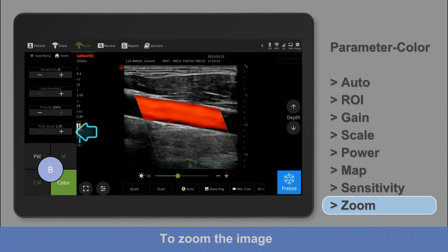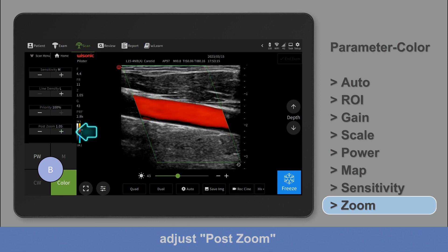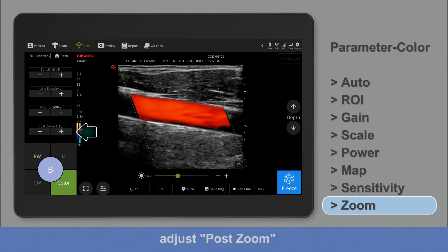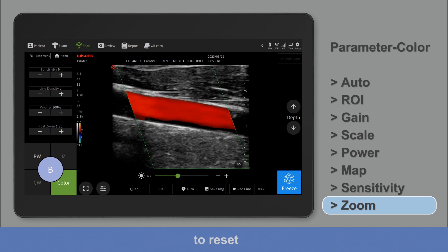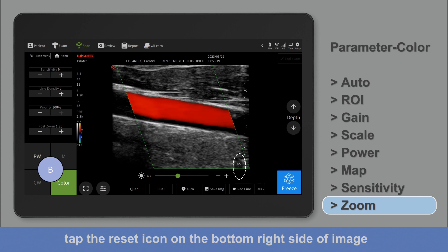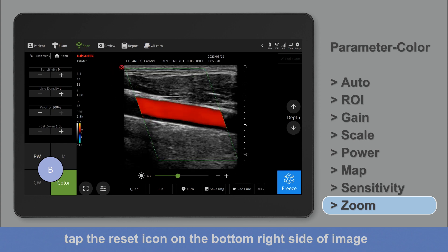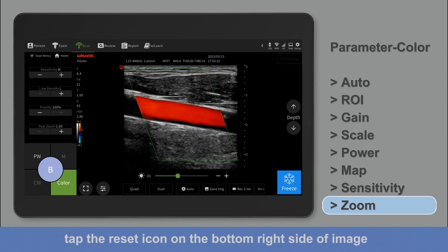To zoom the image, adjust post-zoom. To reset, tap the reset icon on the bottom right side of the image.